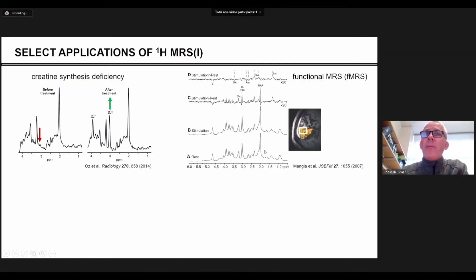A more subtle example is perhaps given by Mangia et al. where they studied metabolic changes during visual activation. So you get a proton spectrum before and during the activation and then the difference will tell you the signals, the metabolites that change in concentration. And lactate and glutamate are the most prominent ones.